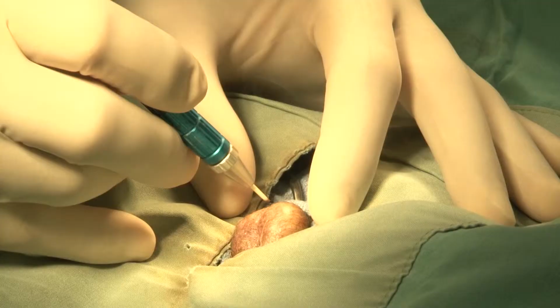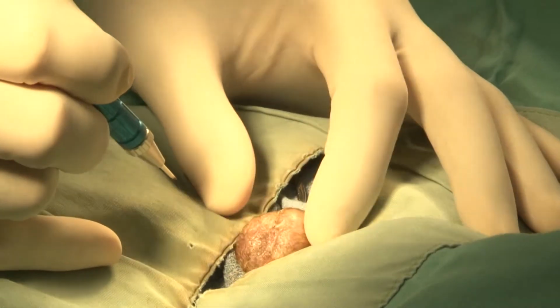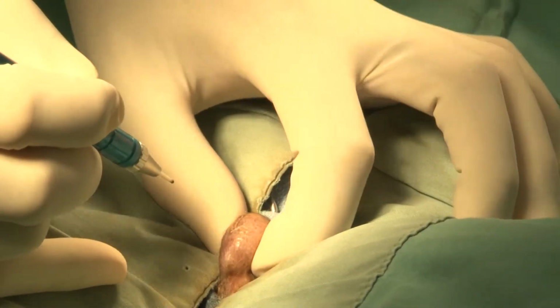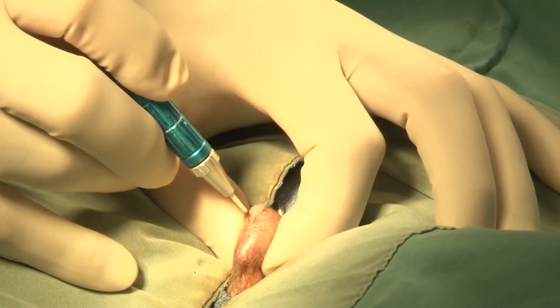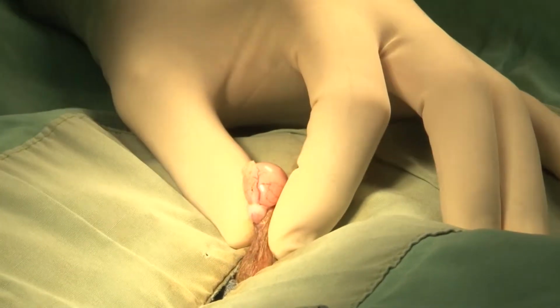You can think of the surgical laser sort of as a laser scalpel, so you don't have to use a metal scalpel blade. And it doesn't cut by burning tissue, which is a common misconception, but it actually just cuts by vaporizing tissue. And so if you were here watching it in use, as you're using the laser to cut, say, through the skin, you'll see what looks like a little smoke rise up, but it's not really smoke, it's just water vapor as the cells are being vaporized.